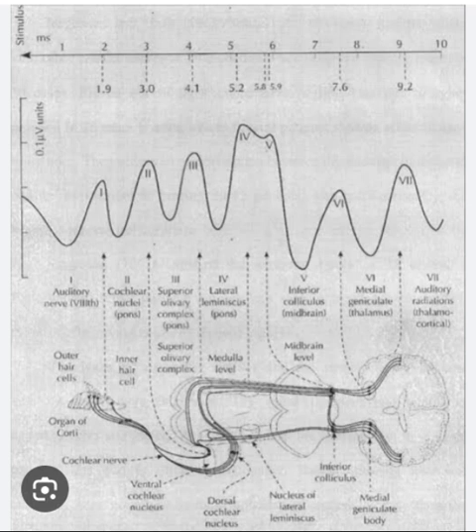Residual noise refers to the unwanted electrical activity that can be present in the recorded signal during a BERA test. This noise can originate from various sources and can affect the clarity and quality of the recorded waveforms. This provides an indication about the quality of the waveform. The lower the residual noise, the higher the quality of the waveform. This is especially useful to consider in cases where no waveform is detected and it is unclear if there is damage to the auditory pathway or poor testing conditions are to blame.